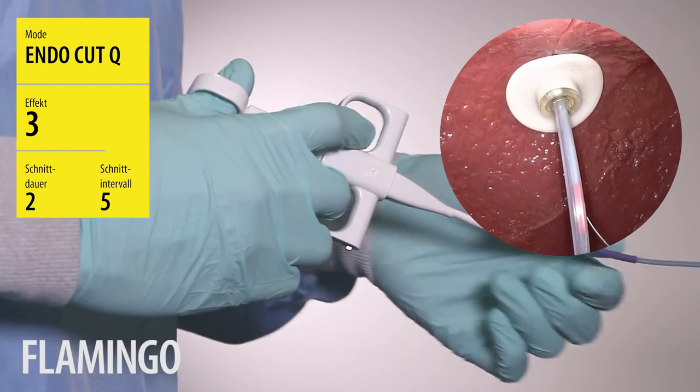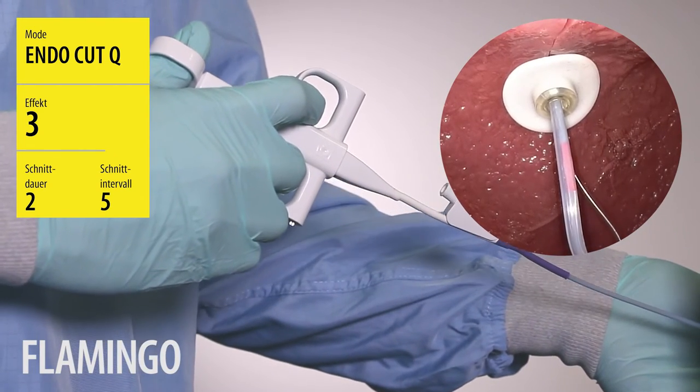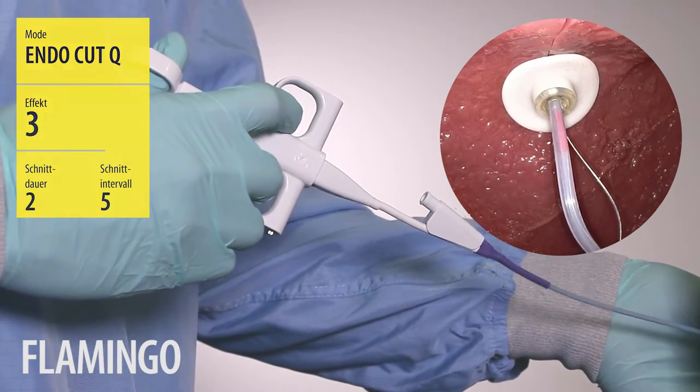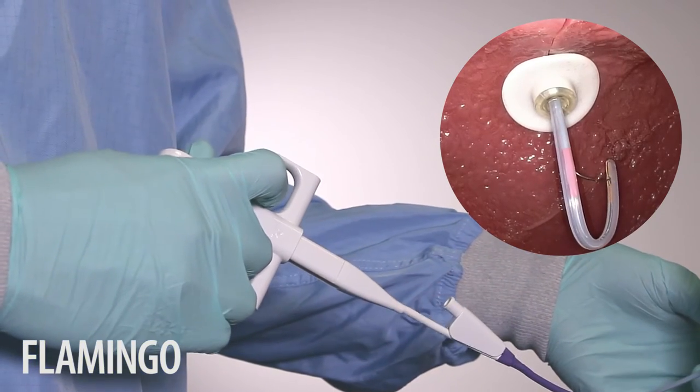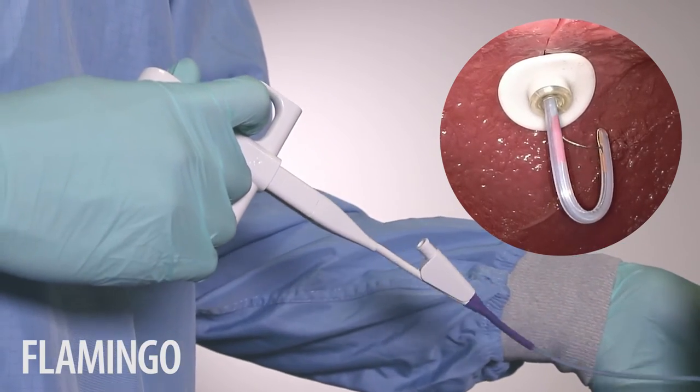Configure the settings shown on your diathermy machine and adjust the angle of the Flamingo until it locks into place at 180 degrees. You should clearly be able to feel it locking into place.